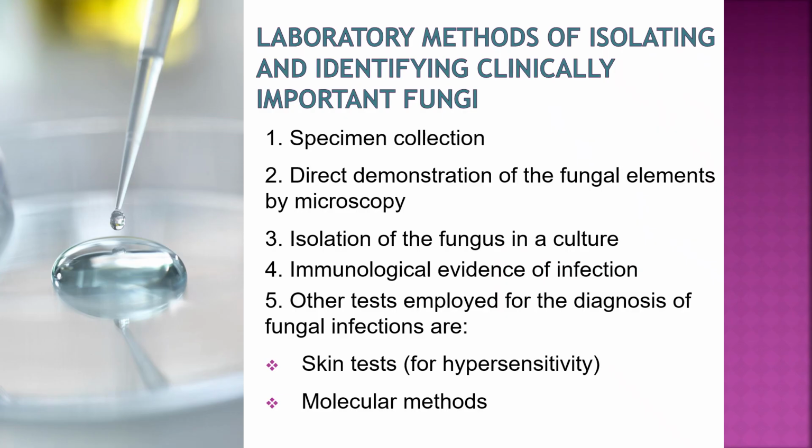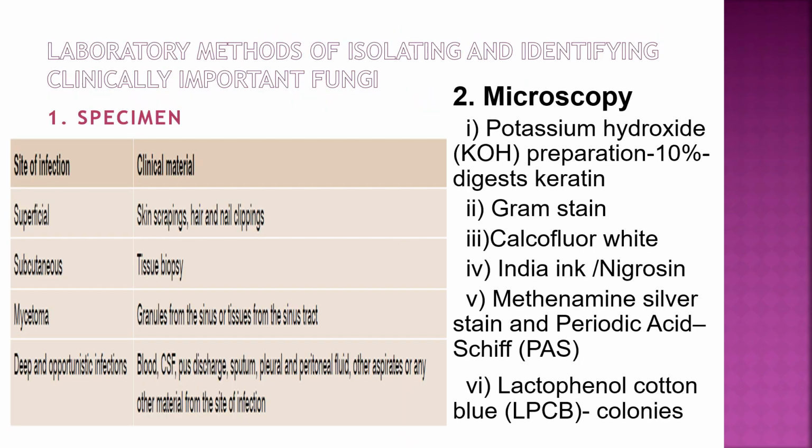Laboratory methods for isolating and identifying clinically important fungi. So first, specimen collection. Second, direct demonstration of fungal elements by microscopy. Third, isolation of the fungus in culture. Four, immunological evidence of infection. Five, other tests for the diagnosis of fungal infection, for example, skin test for hypersensitivity and molecular methods.